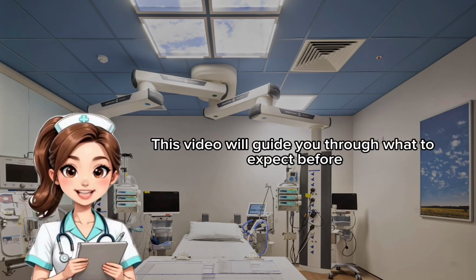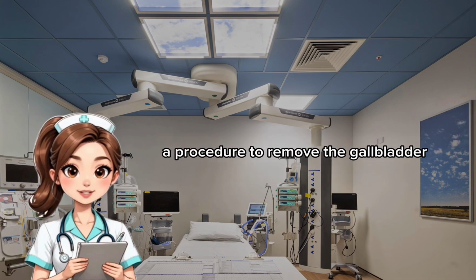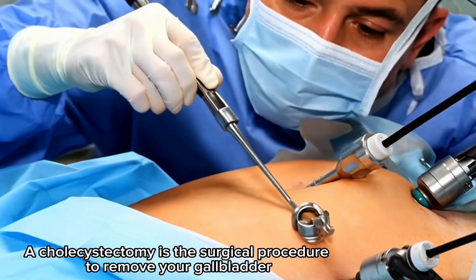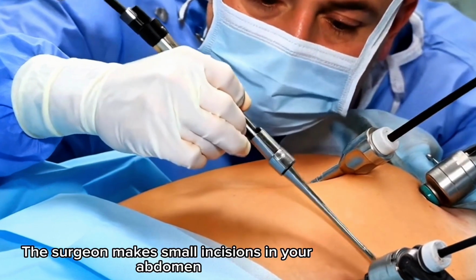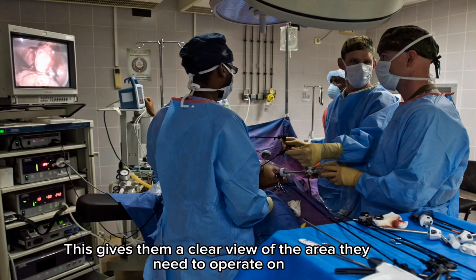This video will guide you through what to expect before, during, and after a laparoscopic cholecystectomy, a procedure to remove the gallbladder. A cholecystectomy is the surgical procedure to remove your gallbladder. It's preferred over traditional surgery because it's less invasive. The surgeon makes small incisions in your abdomen and inserts a laparoscope, a tube with a camera.